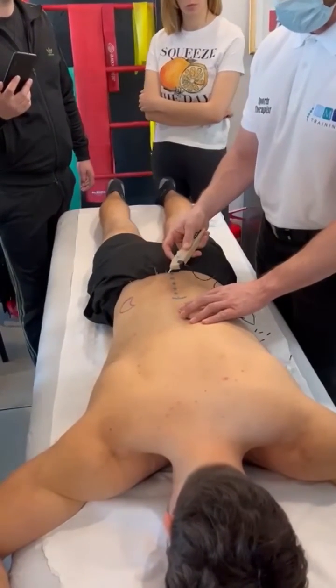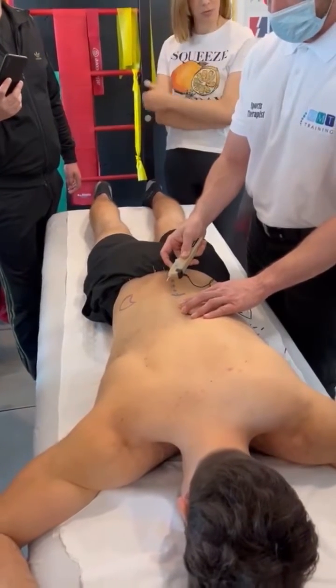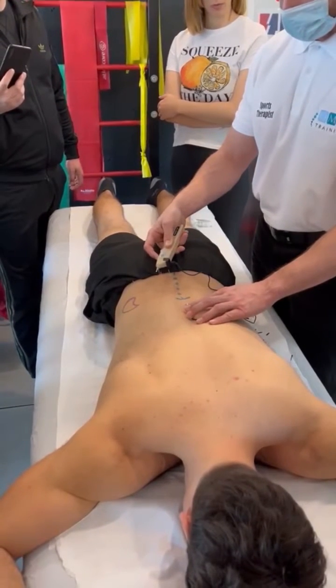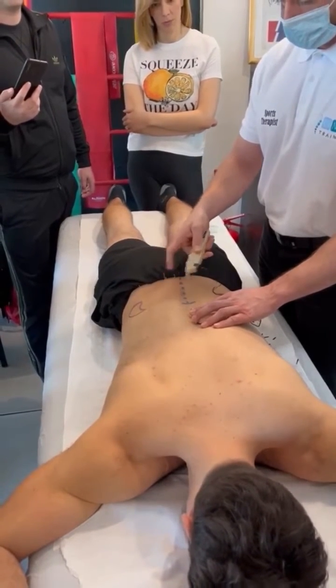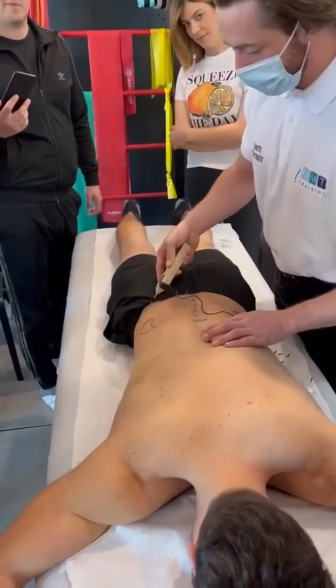I can feel a little bit of feedback through that. There you go, and we can just see a little touch response there into the main bulk of the erectors. There we go, we can see a little touch response there and now we can just see that pulling down towards our crest.